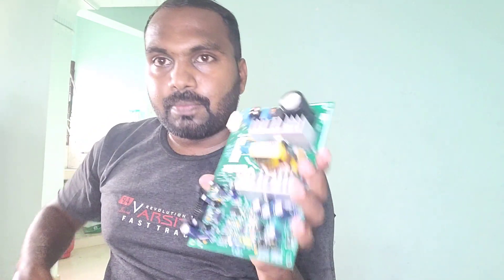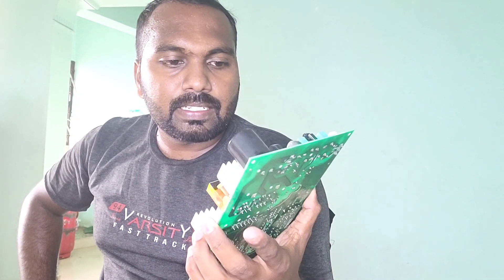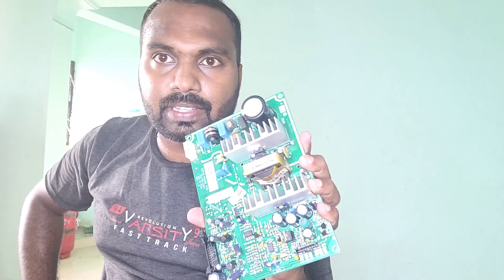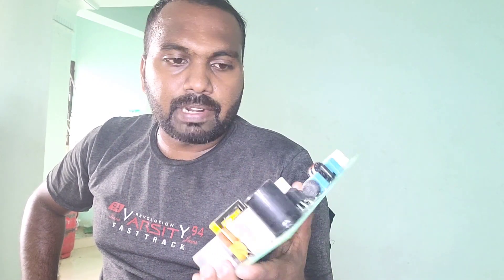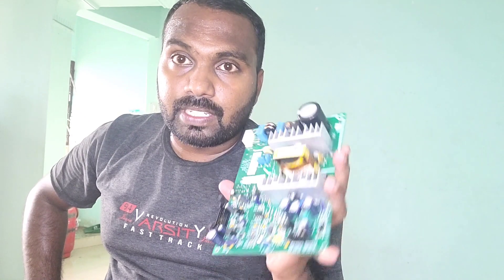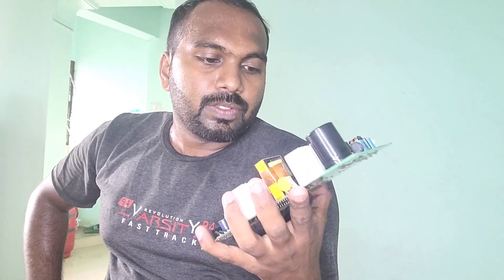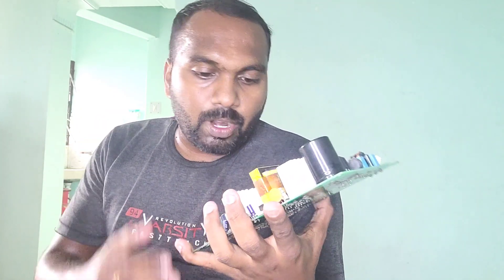Here we have a power supply board from one of my customers. He said the power supply is having a no power issue. The company is BPL and the model is 2509 — it's a monophasic defibrillator. I've seen a lot of 2509 defibrillator boards, and it's easy to find the problem because it has testing points with reference voltages, so we can know whether the voltage is coming or not and identify where the problem is.